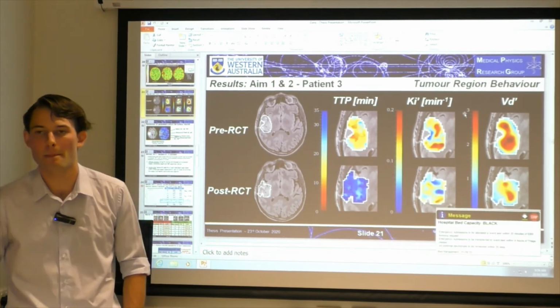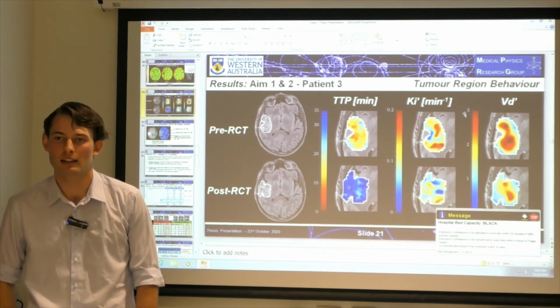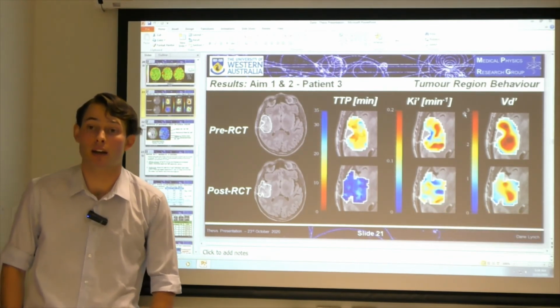Yep. So would you, being a physician, be looking at the parametric maps, or would you be deriving quantitative parameters and comparing those to thresholds for grading?